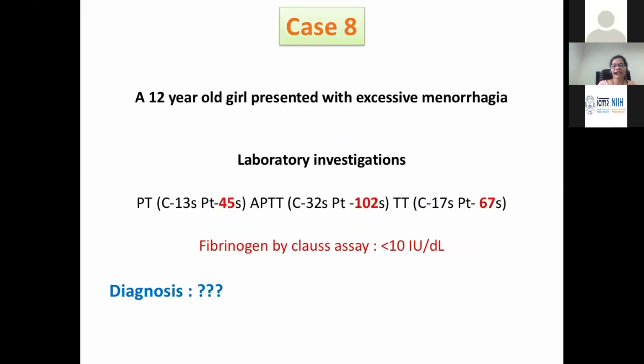What I'm saying is, this is a classical picture of afibrinogenemia, but there may be some clot because of the inaccurate mixing or sample collection, delayed sample mixing. So you should be having one normal parameter when you give a final result to the patient. Now, a clotted sample will also give you a similar picture. There is no parameter which is normal here. So you go ahead, I don't know how many labs will be able to do this.